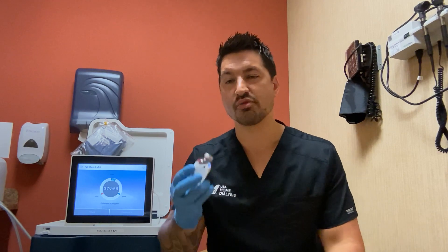Hi guys, Nurse Adam here, USA Home Dialysis. In this training video, we're going to walk through how to properly draw up your heparin medication.